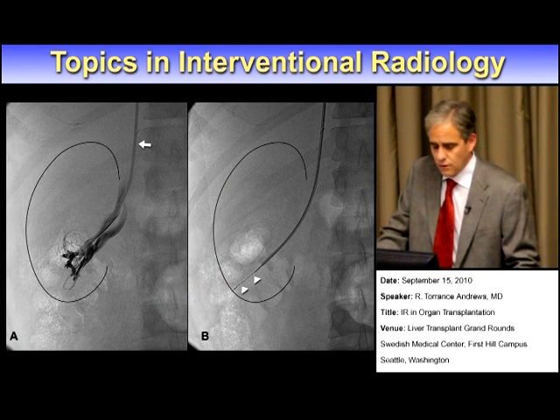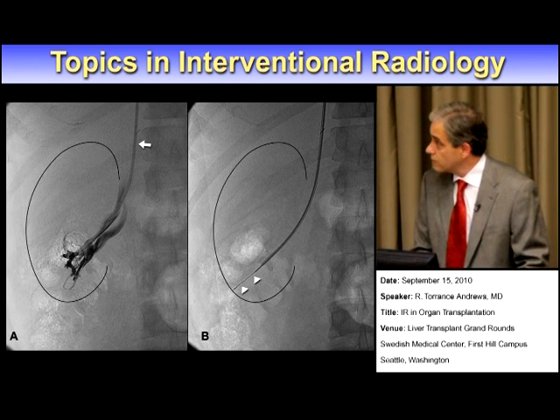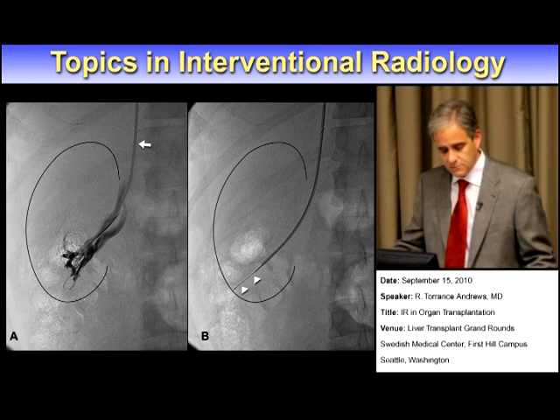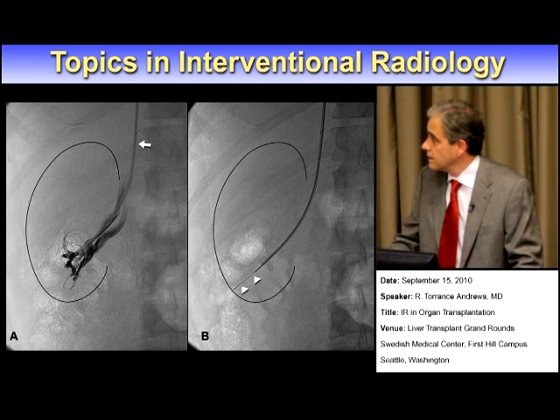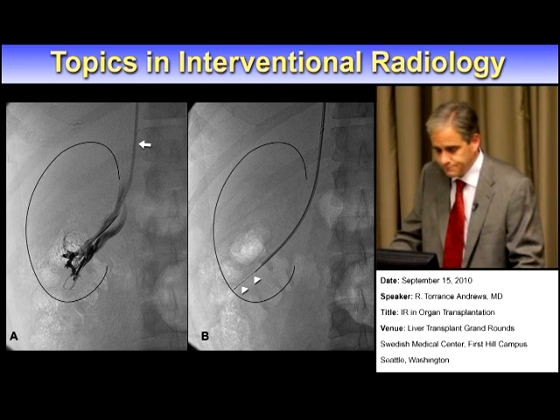Here are some pictures from a sample case. You can see the device coming down through the inferior vena cava and into the renal vein. There's a little bit of contrast being injected to verify that we're in an appropriate position. And in the image on your right, you can see the biopsy needle has been advanced across the parenchyma and is ready to take a core.